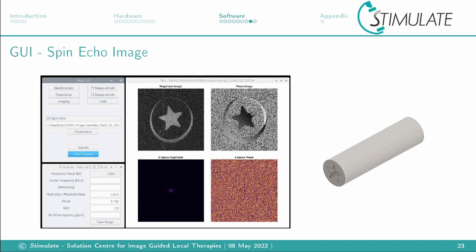Here you see a general spin echo image from a star-shaped 3D printed sample. The sample has a diameter of 8.4 millimeters. The image is 256 by 256 pixels. The software offers lots of different imaging sequences, like gradient echo, spin echo, turbo spin echo, radial imaging, or EPI.